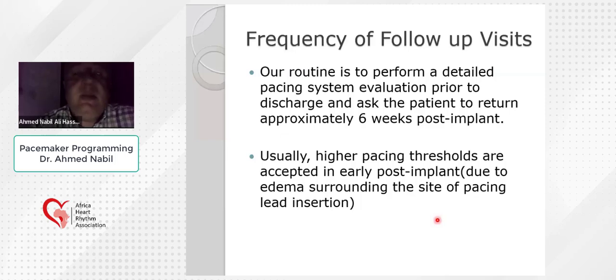We ask the patient to return 6 weeks after implantation for the first follow-up visit, because it is expected that during the 6 weeks, the pacing threshold values increase, as we said, because of the inflammation and edema, and then return back at the end of the 6-week duration. So at 6 weeks after implantation, we can decrease the pacing output according to the values we find at testing.